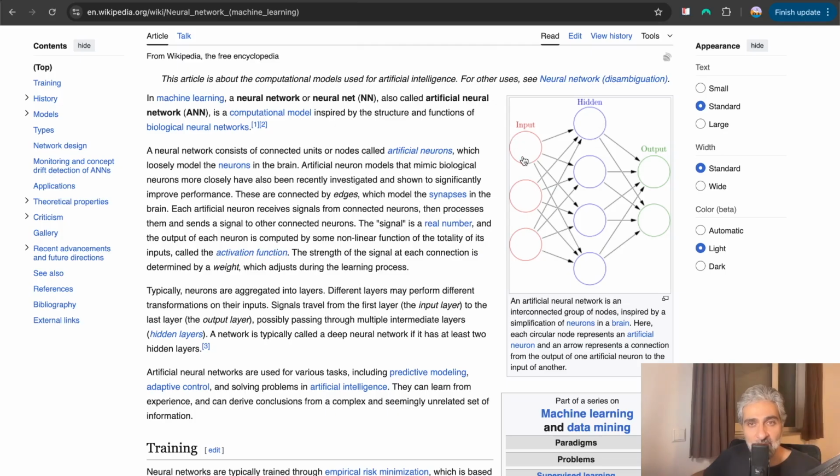So you have an input layer, and these are the hidden layers that we are building, the ones we spent time describing, the convolutional and then max pooling and so on. So you have those hidden layers, and then you have an output layer, the basic way of looking at it. These are neurons stacked together, and if we have 3 layers, you have 3 layers of those. And those arrows are the weights. So those are the synaptic connections that we have seen in the biological neuron, represented by the weights.